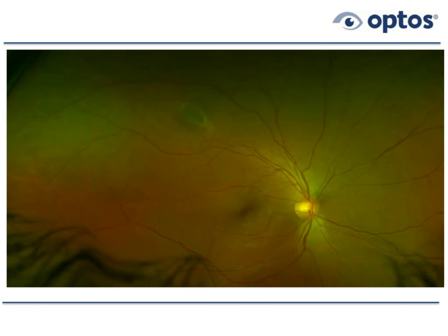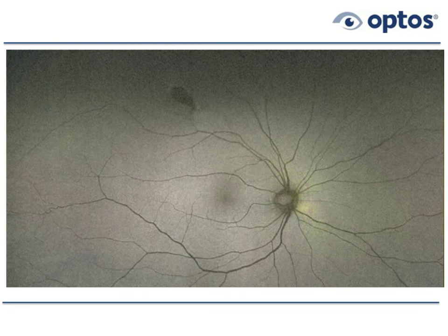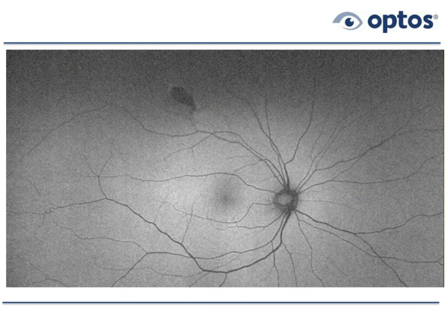Here's a CHRPE lesion from a resident of mine — supratemporally in the right eye, a darkish lesion. On autofluorescence it appears dark. OCTs through this show congenital hypertrophy with RPE still present, but the photoreceptor integrity line above it is actually missing. The nevi will disappear on autofluorescence, while CHRPE lesions will show up as dark lesions.